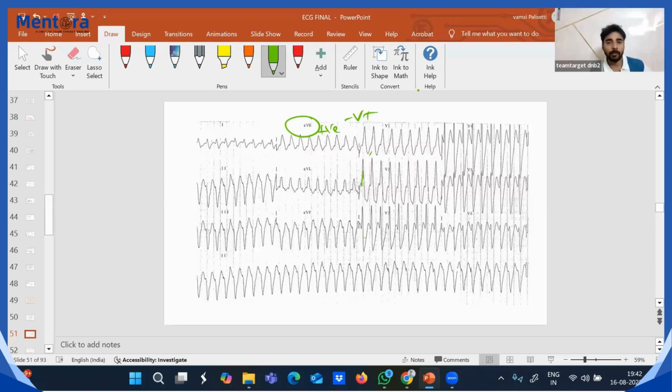Here, see, this is one more important ECG. What we studied is the left rabbit ear again, but it's not a left rabbit ear. Left is small. When you compare this, right is big.